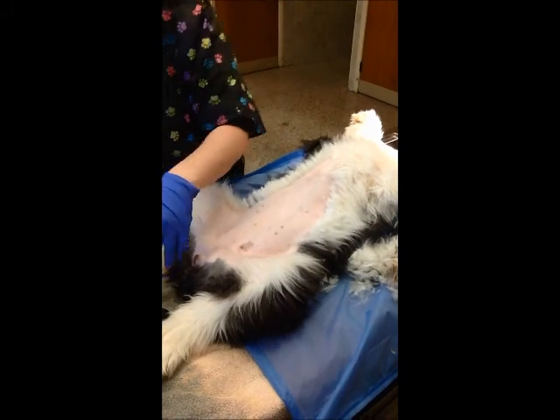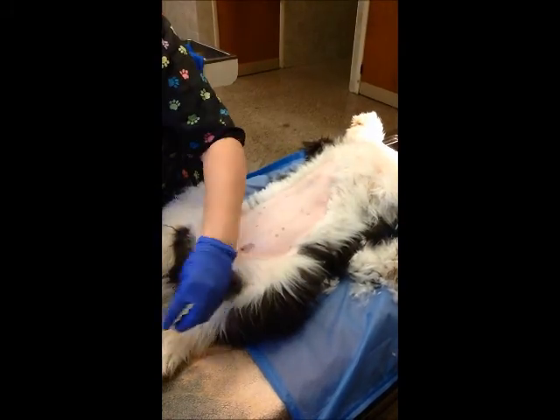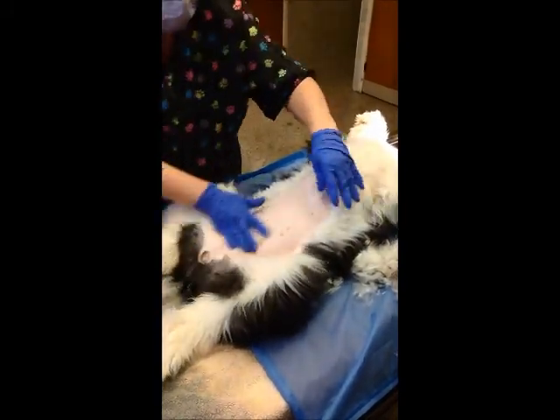You can vacuum. I'm going to express the bladder, all of our extra hair out of the way.